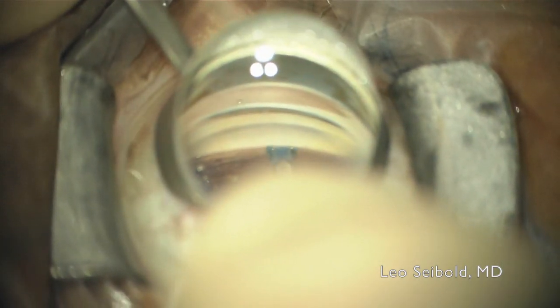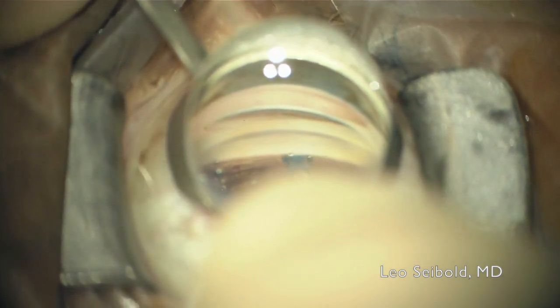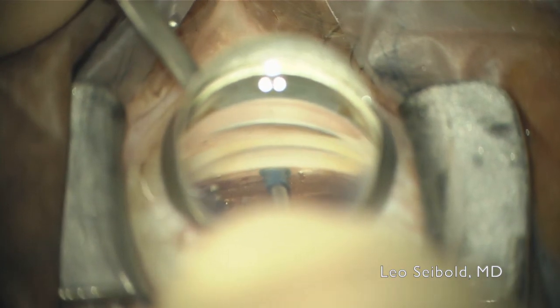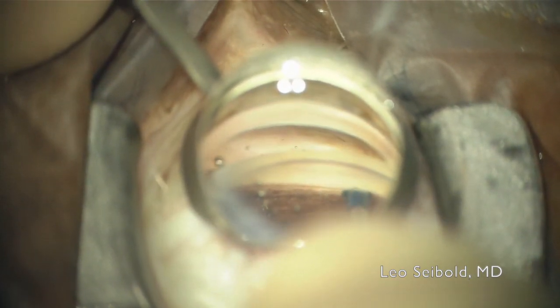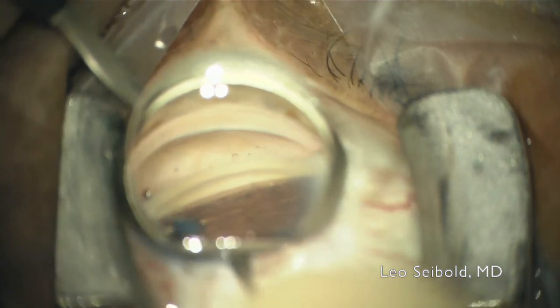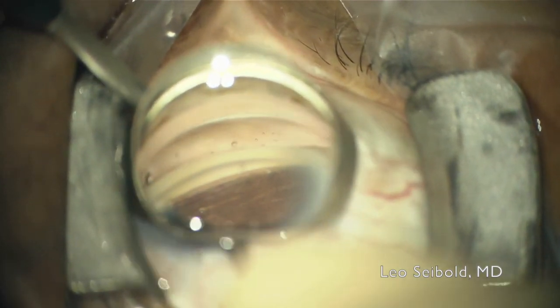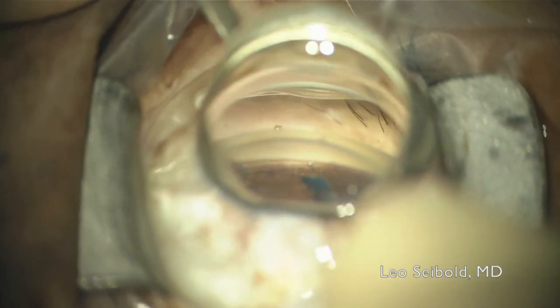After this last goniotomy and OVD injection, I'm going to keep the cannula out by holding the button and I'm going to extend my initial goniotomy incision laterally. You have the ability to do this and titrate the size of the goniotomy incision across multiple clock hours along with the OVD injection. So overall, with Streamline you can perform a very precise and safe goniotomy that is titratable according to surgeon preference. Thank you.